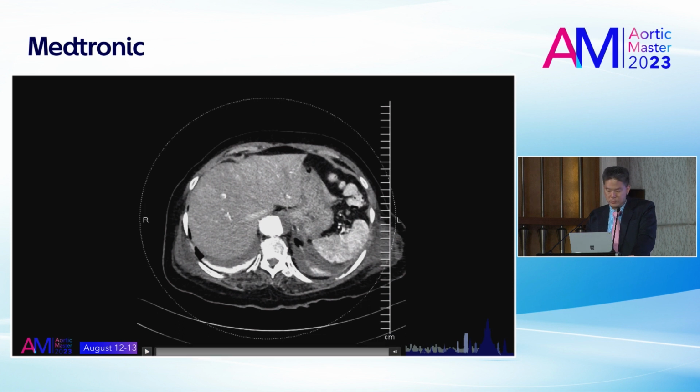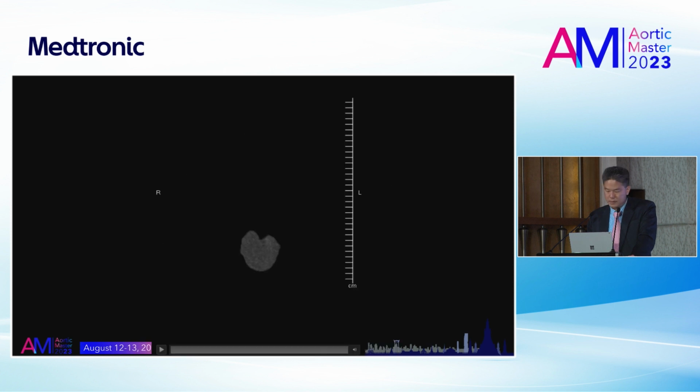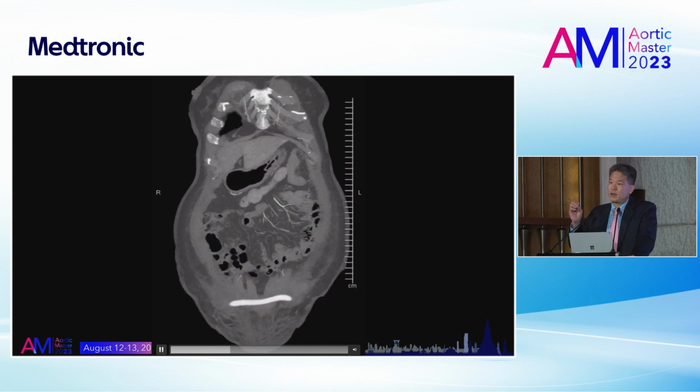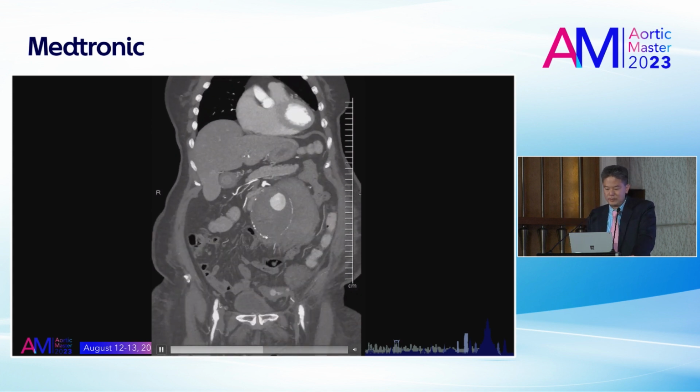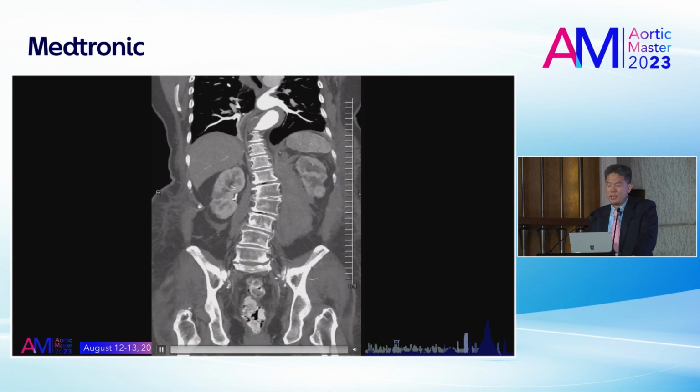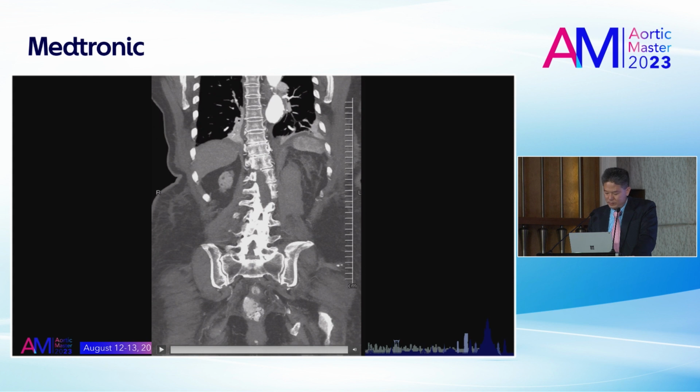Let's see, it's not running. Sorry about that. There's a type 1A endoleak now. The stent has dropped down about 5 millimeters. So now we have a problem. The patient is post AUI and now has a type 1A endoleak, with a ruptured aneurysm previously.